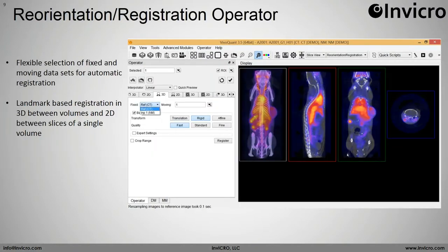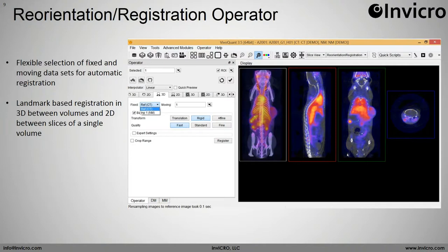The next tool we've worked on significantly this release cycle is the reorientation and registration operator, which is very important in the preprocessing workflow. We've changed our approach to fixed and moving data. Previously, when doing automatic registration you could register input data to the reference, which was generally a CT or MR. We found the reference isn't always the dataset you want to use, so we now offer the ability to select your fixed dataset — whether registering PET to a CT or MR, or performing multiple registration steps to correct for motion.